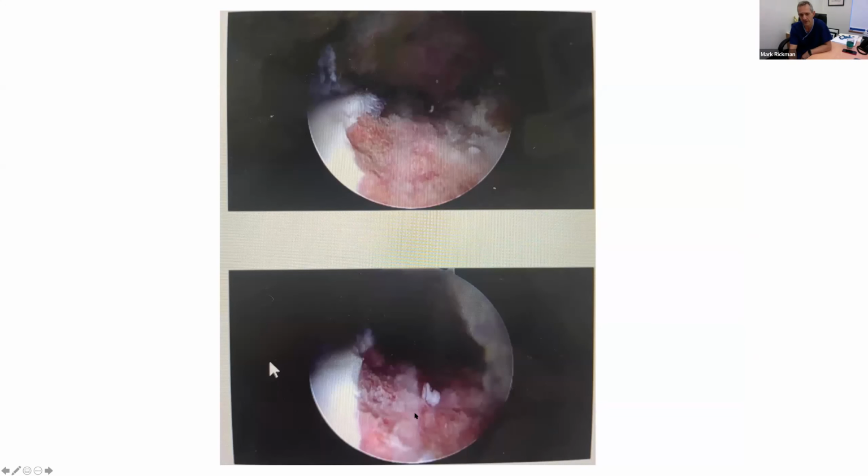And so that's him towards the end of our debridement. We just sort of take all of this away. His outlook is not terrible. I think symptomatically he was much better by 2 weeks. He was very happy. He's about 5 weeks now. But I don't know what the long-term outlook is for a hip when they've had that amount of chondral damage at his age.